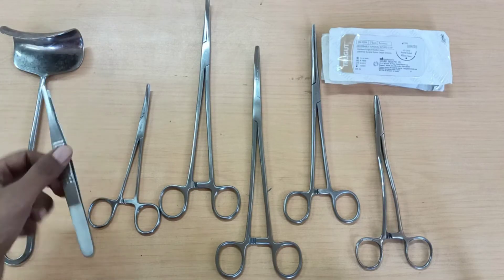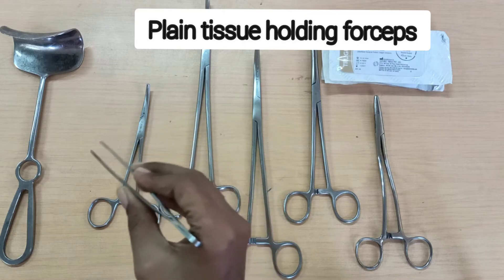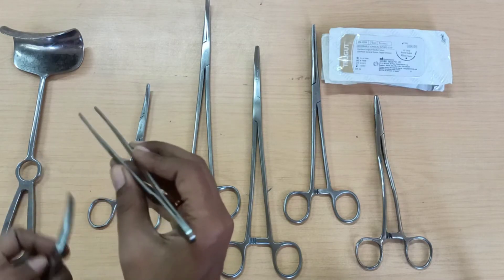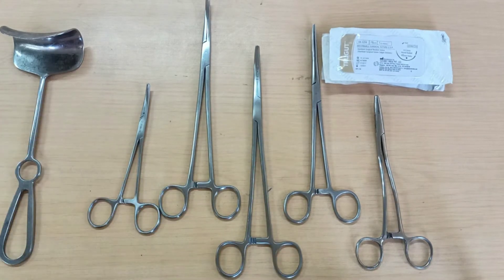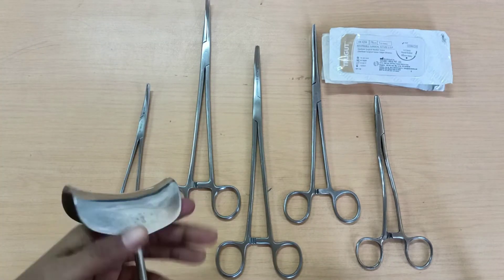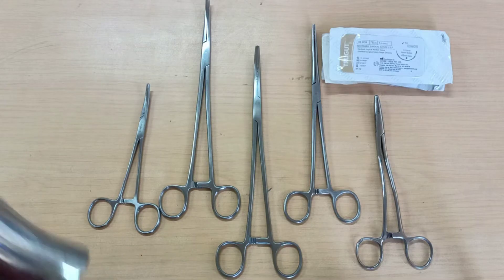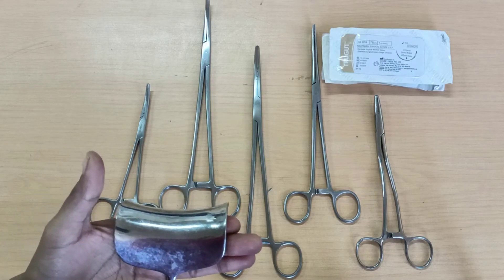Next you are going to require a plain tissue holding forceps to move the visceral peritoneum over the lower uterine segment — from where it is freely attached over the uterus and passing over to the bladder — and that is where you need to incise it horizontally, so that you can make an incision and push the bladder down. After pushing the bladder down, you advance your Doyne's retractor so that the visceral peritoneum is also retracted laterally, and you can see the lower uterine segment clearly.